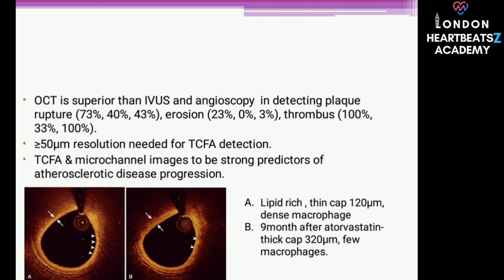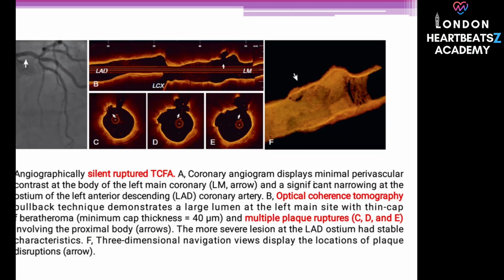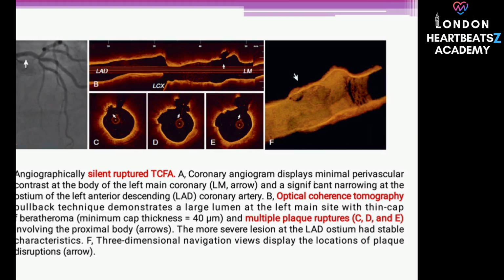And when it comes to identifying those high-risk vulnerable plaques, how does OCT compare to IVUS in its ability to detect the key features? OCT really excels here due to its superior resolution. It can reliably identify large lipid cores. Critically, it can also very accurately measure the thickness of the fibrous cap covering the lipid core. Measuring the cap thickness. Yes, a thin-cap fibroatheroma, TCFA, a key marker of vulnerability, is defined by OCT as having a cap thickness of less than 65 micrometers, a measurement very difficult for IVUS to achieve reliably.